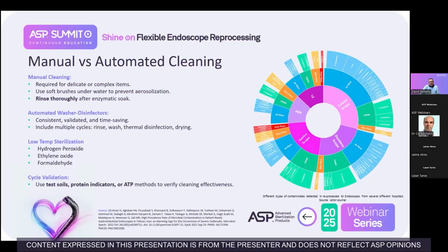So these developments are reflecting a growing shift towards integrated, validated and efficient sterilisation solutions in response to evolving clinical demands, and of course, infection prevention. With ST91 and AS 5369, they both stress the importance of following device-specific IFUs as well, to select the correct sterilisation method, packaging, and all the rest of it. And there are manufacturers now validating their flexible endoscopes through low temperature hydrogen peroxide, as well as through the AERs.